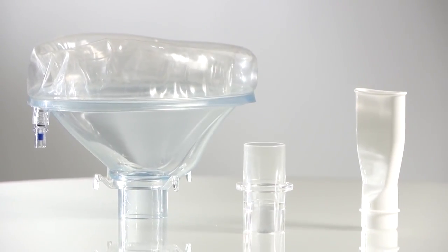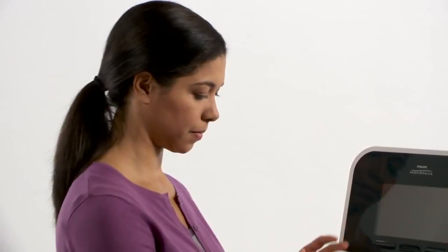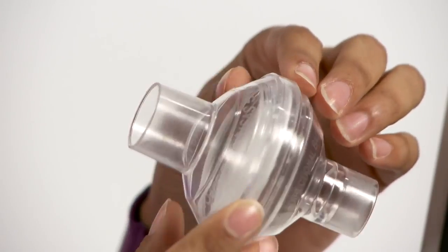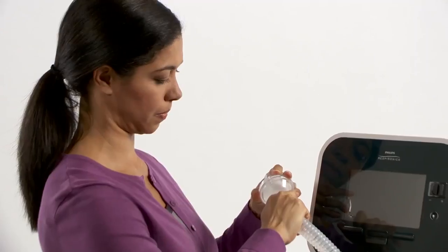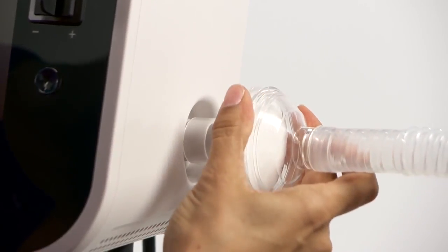CoughAssist T70 can be used with a mask, tracheostomy tube, or mouthpiece. To build the patient breathing circuit, attach a bacteria filter to the breathing circuit connection. Attach the circuit tubing to the bacteria filter. Press the filter onto the connector on the side of the device.